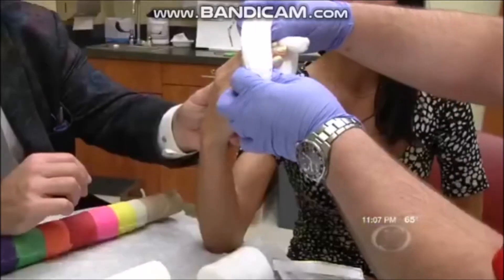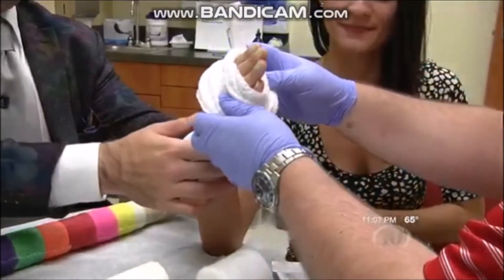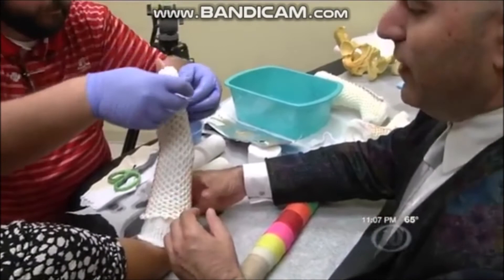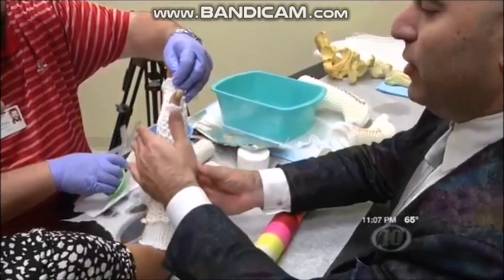Dr. Rosensweig even gave a demonstration of how the cast works. With this new Osteofix casting, you just kind of roll it into a ball, then slide it over the skin. At this point it's still wet so you can still mold the cast. If the break was a little bit unstable and you wanted to put any pressure points, you could at this point.